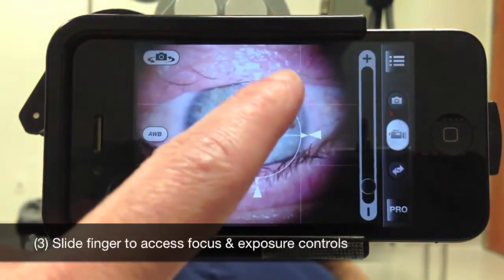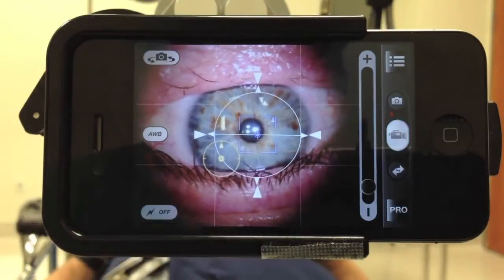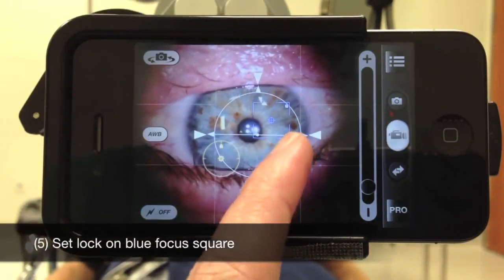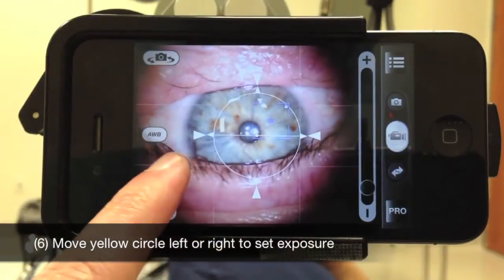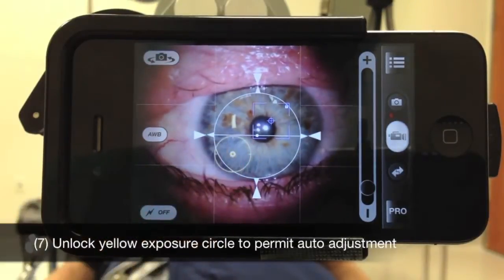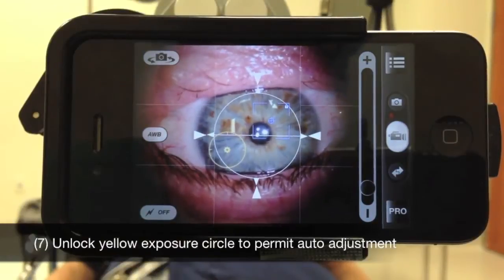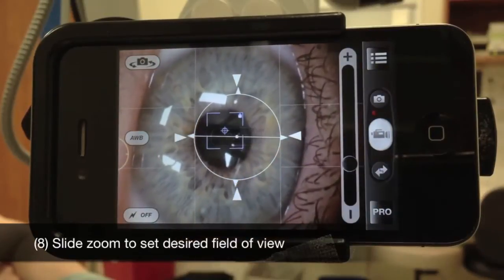Slide your finger across the screen to access the blue focus square and the yellow exposure circle. Move the blue square over the area where the surgeon is focused. Hold your finger over the square until you see the closed lock icon. Move the yellow circle back and forth across the screen in order to set the optimal exposure. Hold your finger over the yellow circle until you see the lock icon disappear — this will allow the exposure to automatically adjust throughout the case. Finally, slide the zoom bar on the right of the screen up and down to set your desired field of view.